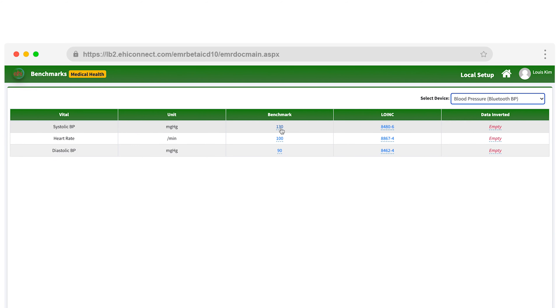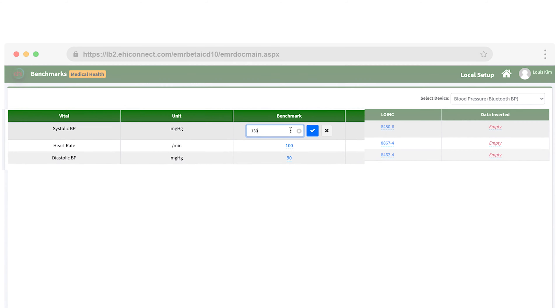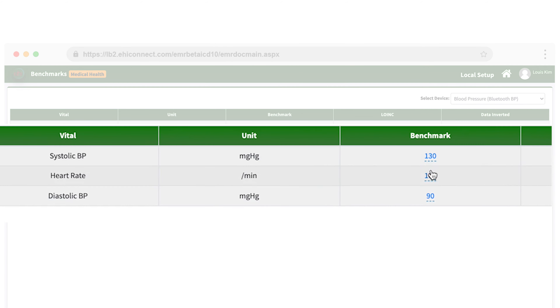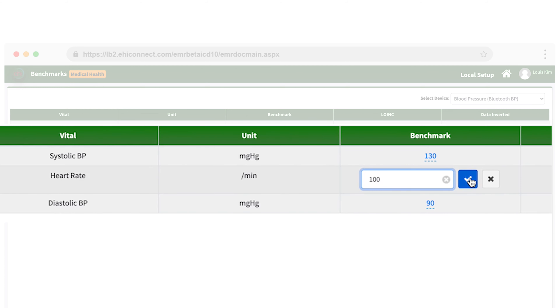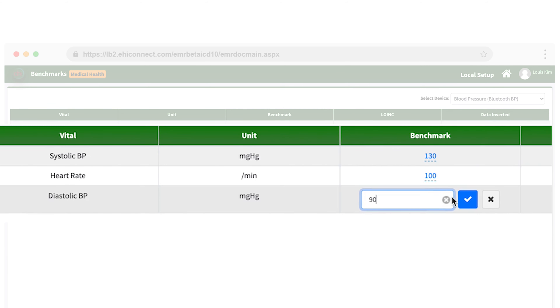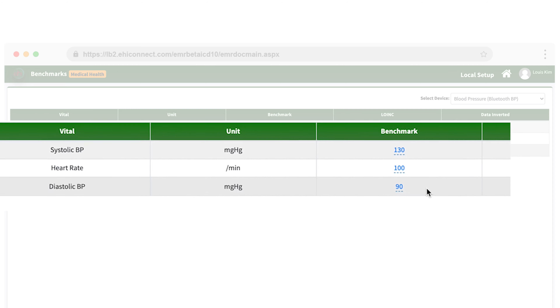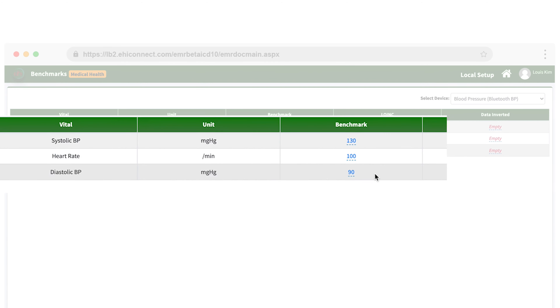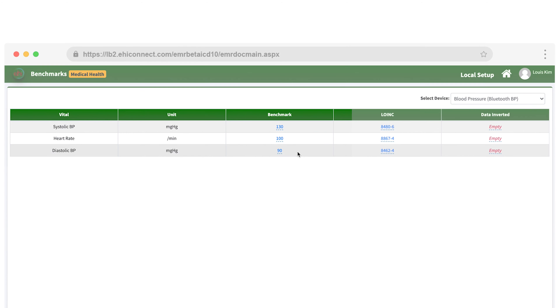Under Benchmarks, you can set special benchmarks for patients that might not follow the conventional reading benchmarks. And under Billing, you can view all patients who have open claims for the current month.